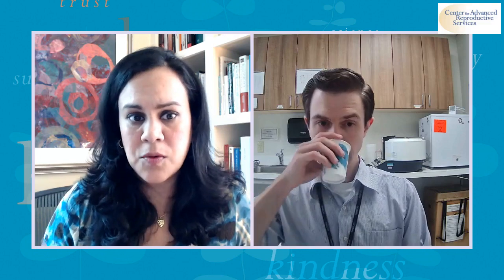What is the process for having a semen analysis with us at CARS? Well, first you should talk to your doctor, whoever that may be, and see why you should get a semen analysis and decide that you need one. You're going to get a lab order or a requisition from your doctor.